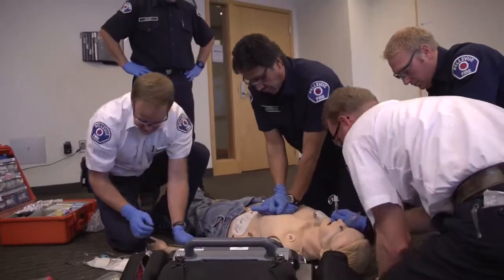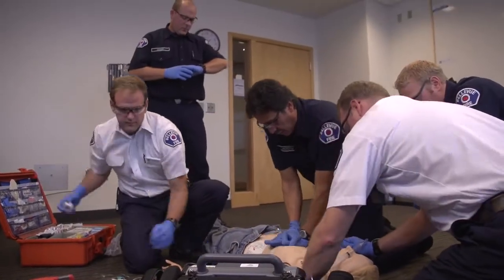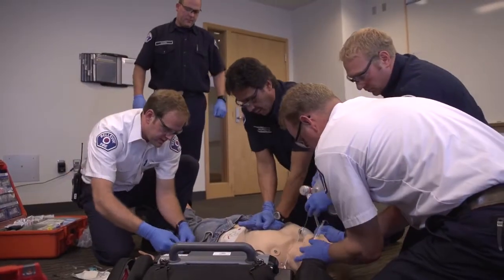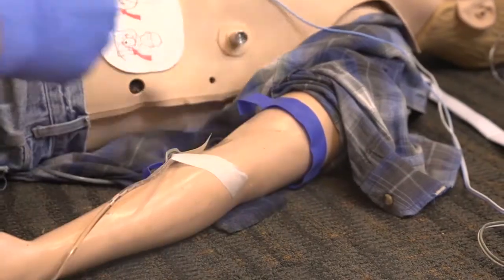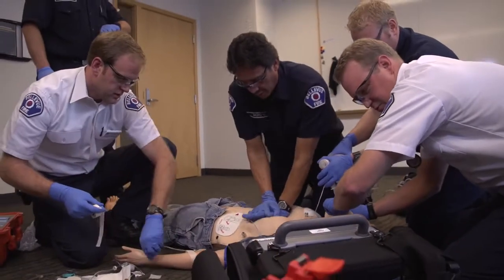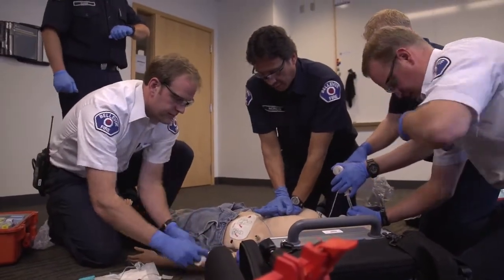Tube's passed the cords. IV secured. 30. Who's on timer right now? 30 seconds in. Go ahead and let me know. 30 seconds remaining. 15 seconds remaining. So we can do a charge if needed. One more. We've got a nice waveform.